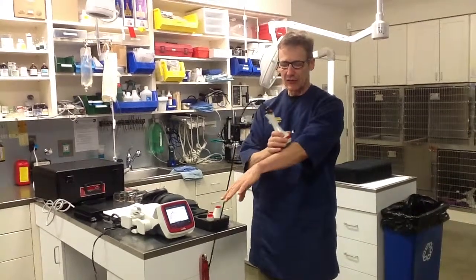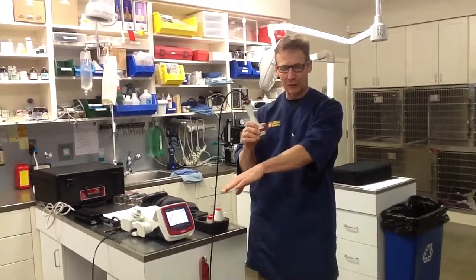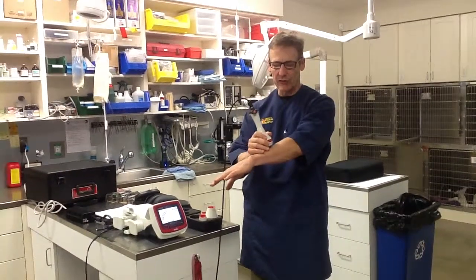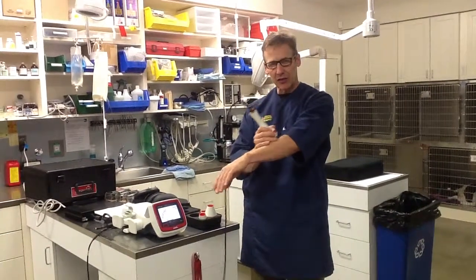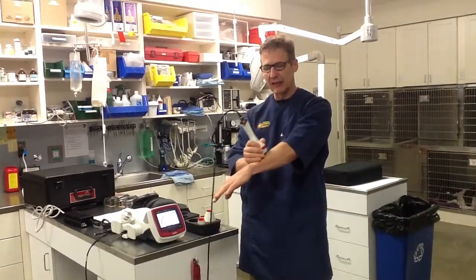What the contact head does is give you much better penetration of the light into the tissue. Anytime you're in the non-contact position, you're going to have about 60% more light reflected than when you're in the contact position. You're also going to be deforming and blanching the tissues, so you get deeper penetration and a myofascial trigger point release — it's sort of a massaging technique as well.